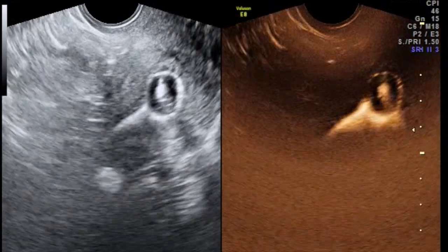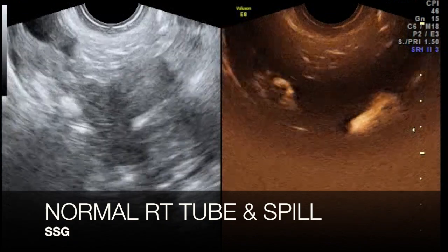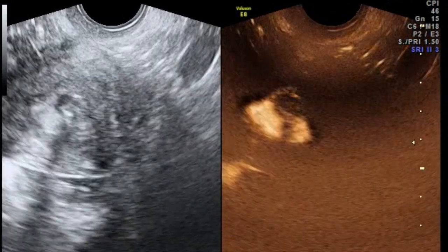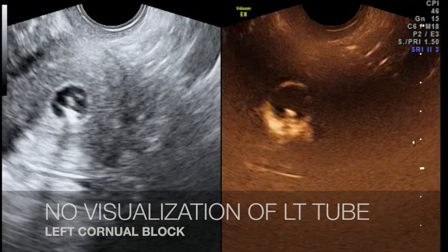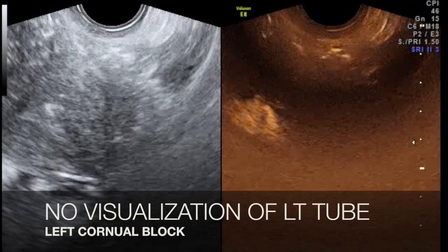In this case, you can see the contrast flowing in the right fallopian tube right up to the fimbrial end, and an immediate spill. But on the left side, there is no flow of the contrast beyond the cornual end, suggestive of a left cornual block.